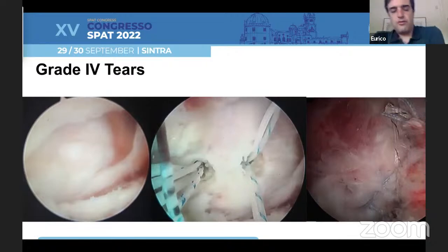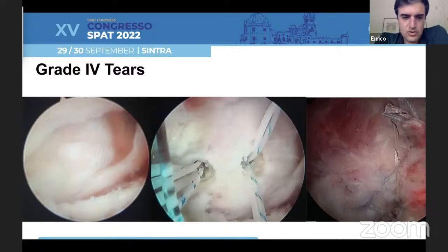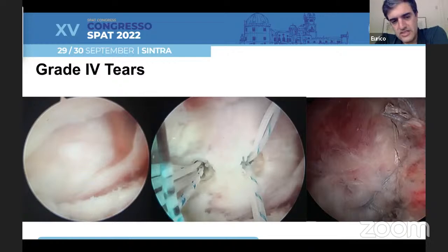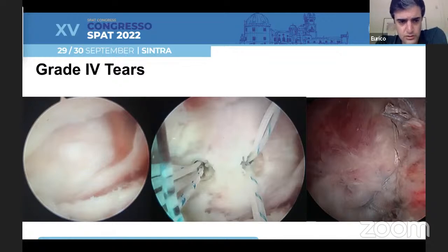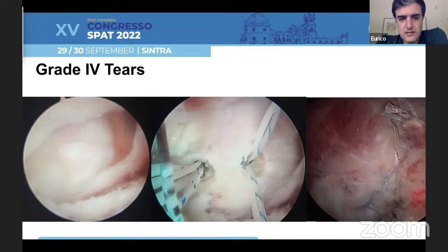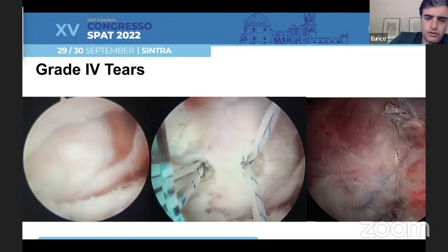More difficult are grade four tears when we have a complete tear without much retraction. When we go into the peritrochanteric space, we can see the gluteus medius leaflets — anterolateral and anteromedial — and also the minimus tendon insertion. We go straight forward to face the bald spot. Sometimes we have some osteophytes on that region that we have to clean, exactly like we do on the shoulder. Then we can place our anchors and perform our repair.